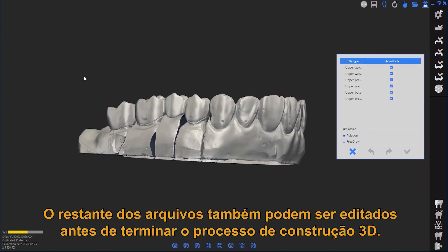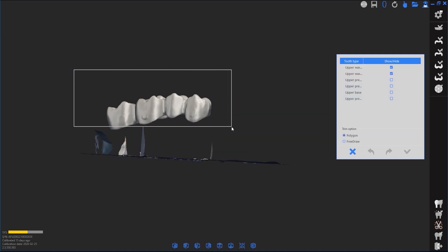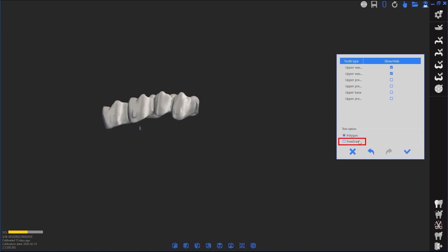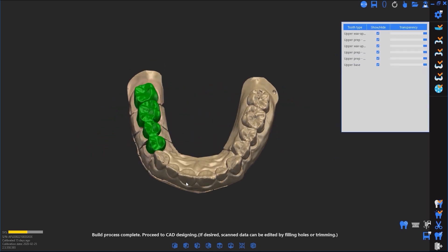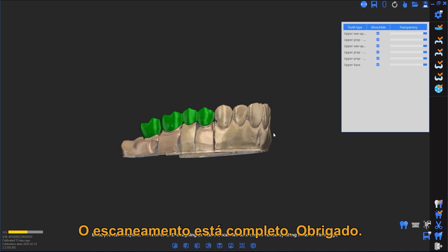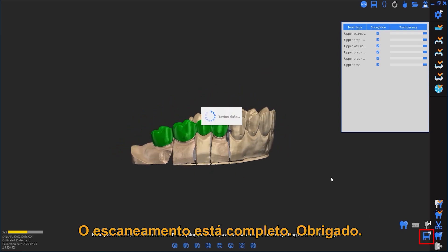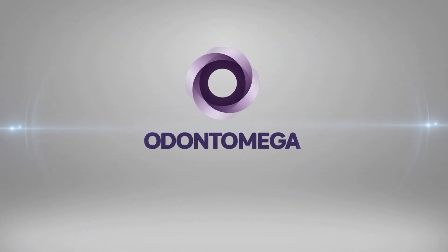Scan data may also be edited after the build process. Scan complete, thank you!